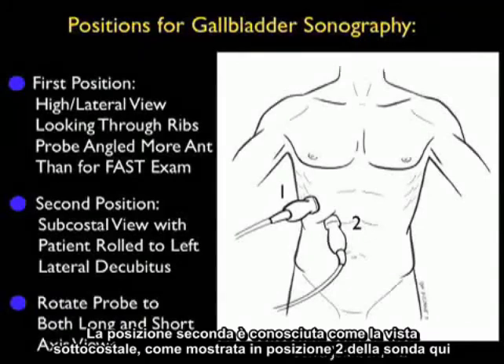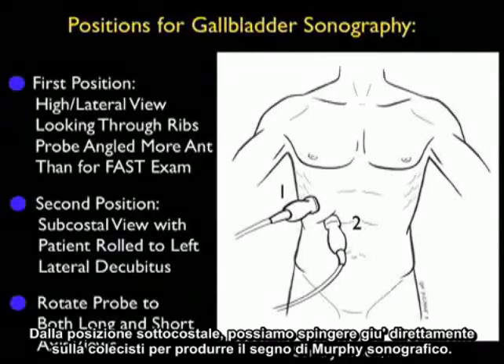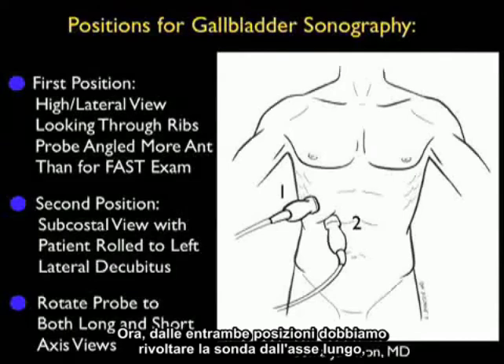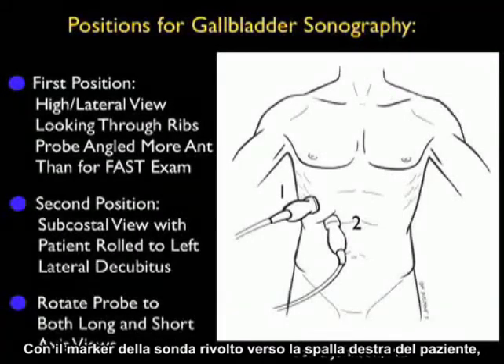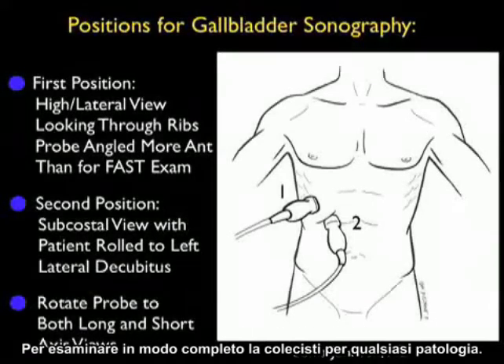The second position is known as the subcostal view, as shown in probe position two. It's best to roll the patient into the left lateral decubitus position so that the gallbladder is closer to the probe. From the subcostal position, we can push down directly on the gallbladder to elicit the sonographic Murphy's sign. From both positions, we should rotate the probe from long axis with the probe marker towards the patient's right shoulder to the short axis configuration with the probe marker towards the right side to completely inspect the gallbladder for any pathology.